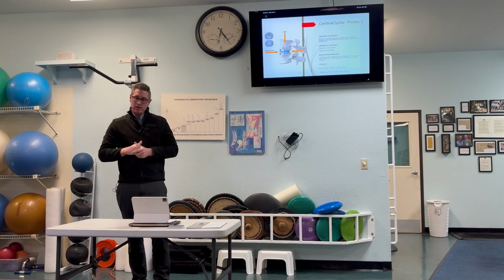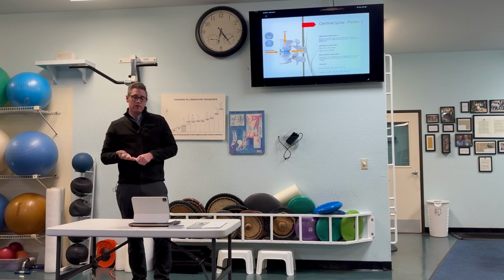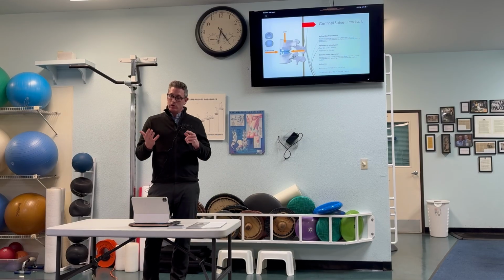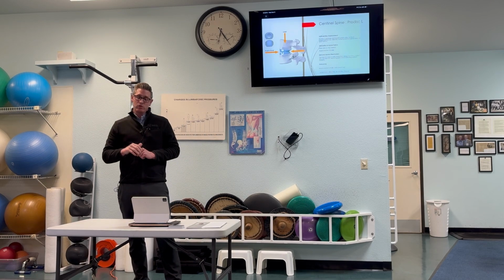This has been very stable, and the overall outcomes for this have been very good. The ProDisc L studies are probably the most thoroughly studied of all the implants, and again it is the only one on the market today. They've demonstrated very good results at 2 months after surgery, 2 years after surgery, 10 years after surgery, and currently have 20-year data that has shown overall improvement in 2 primary measures, what we call the visual analog scale and the ODI. Those are probably the 2 primary measures that we utilize the most in spine surgery.